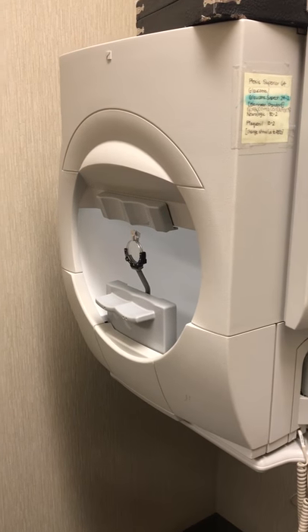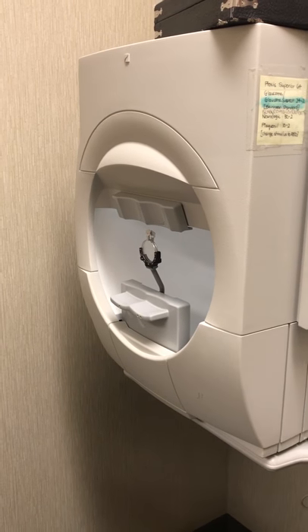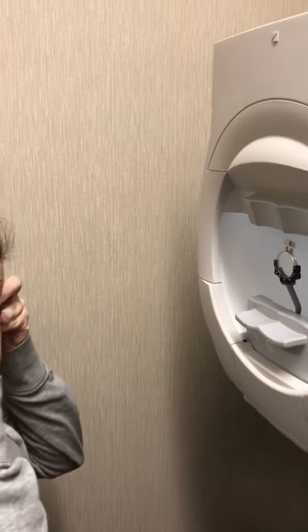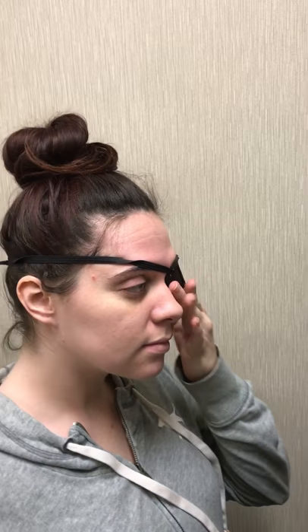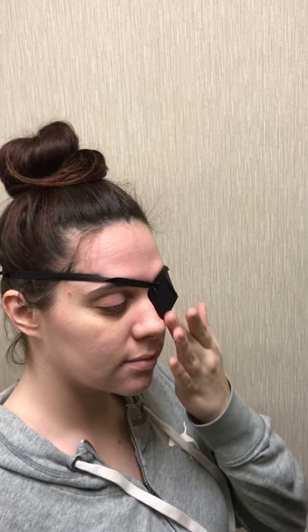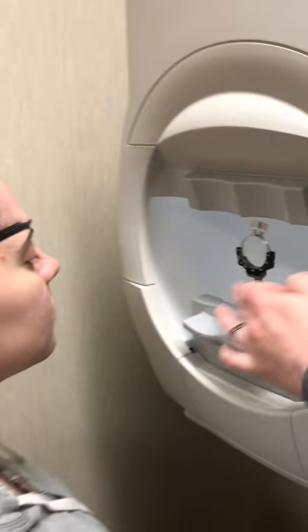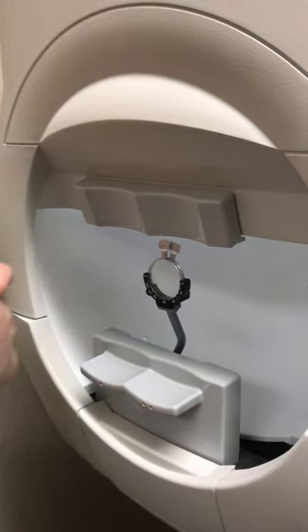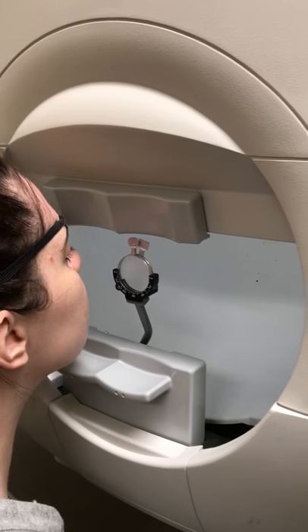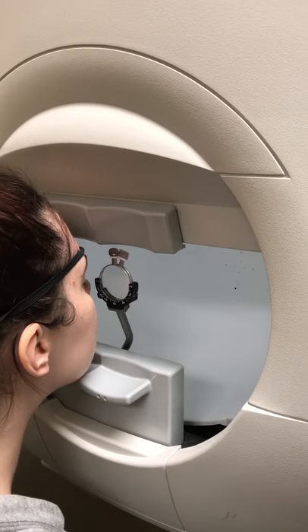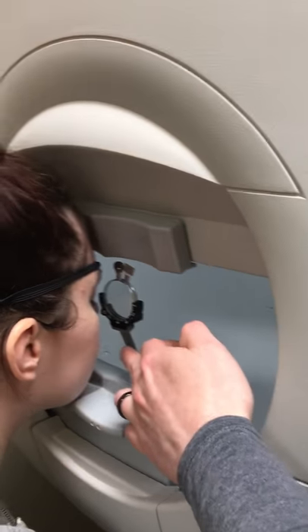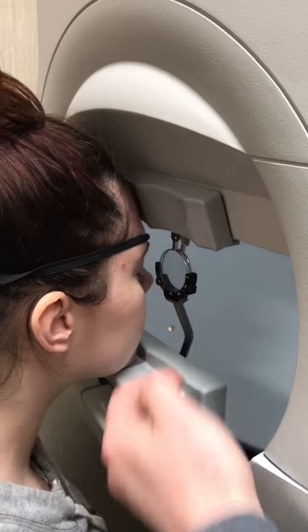It's always important to make sure that their patch is completely covering their eye and they can't see anything out of it. Then they're going to sit at the left hand chin rest. The chin will go down and forehead will go all the way forward there.